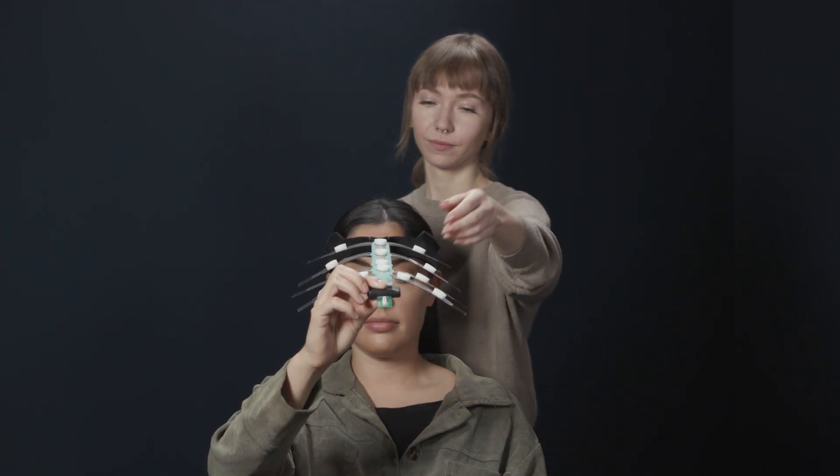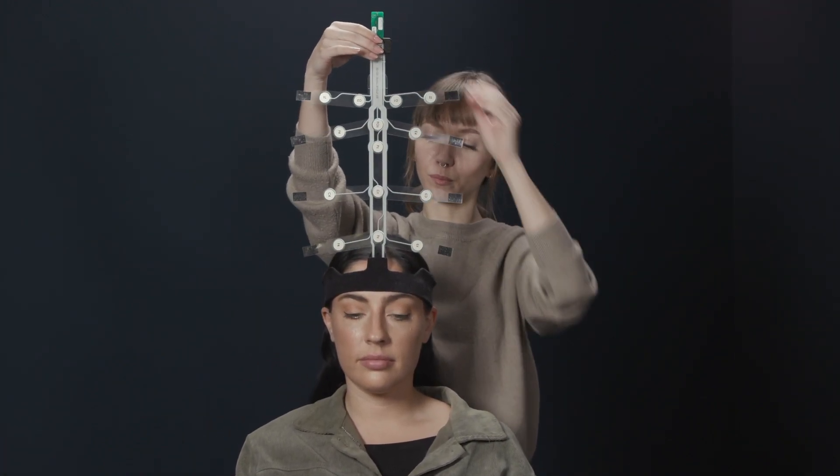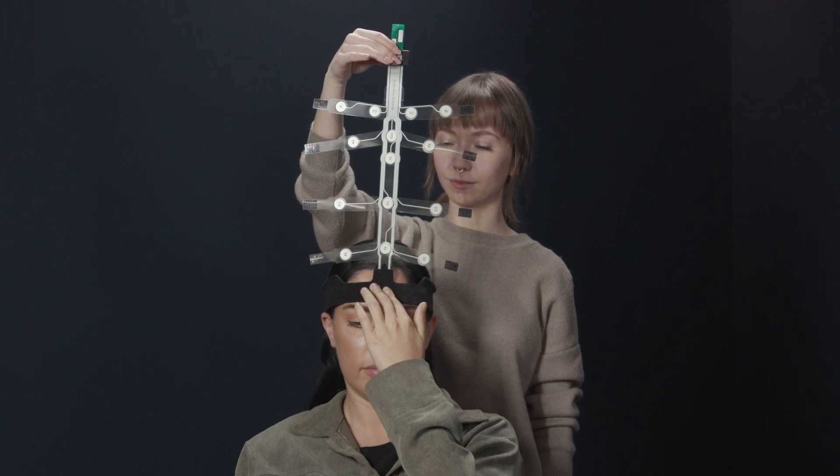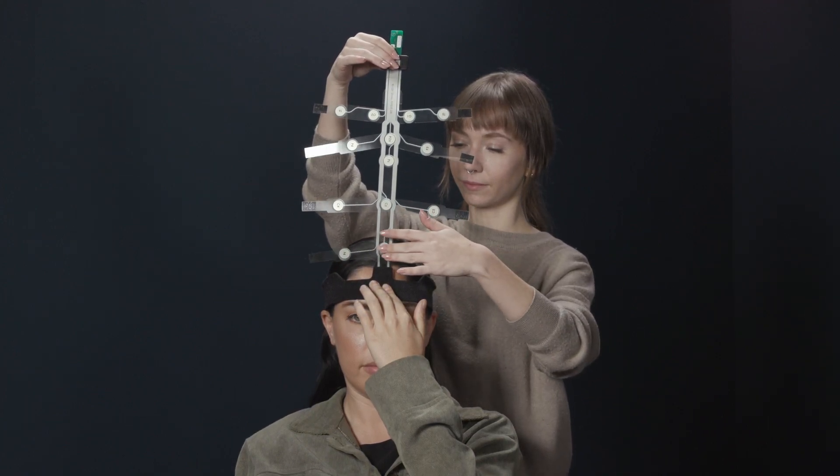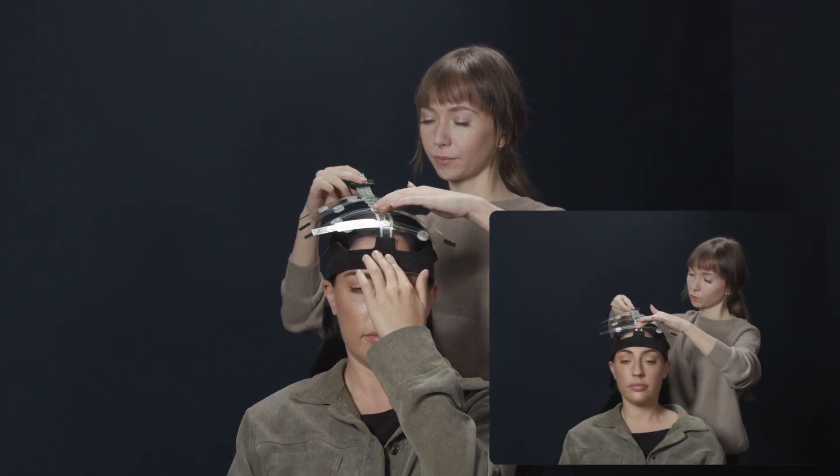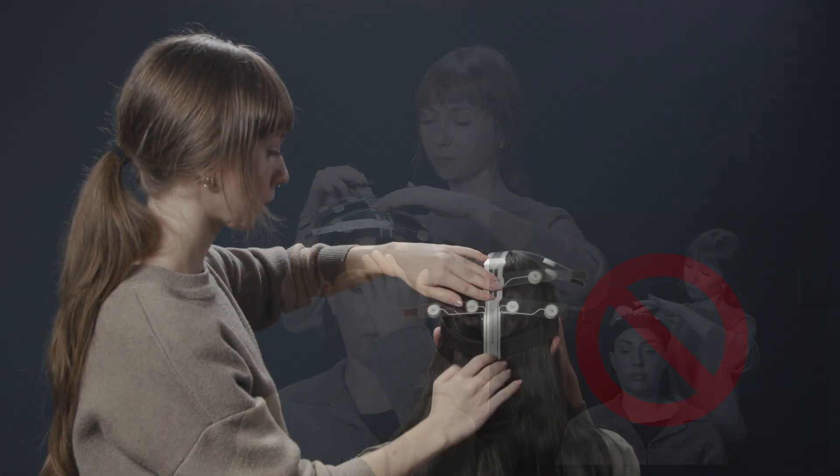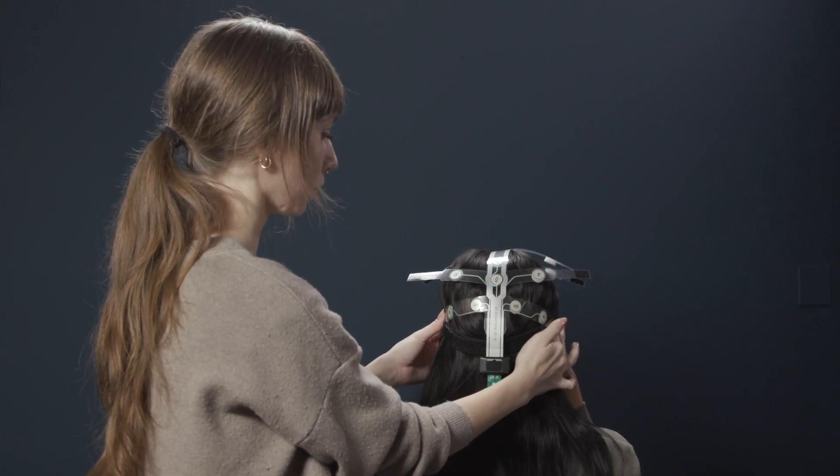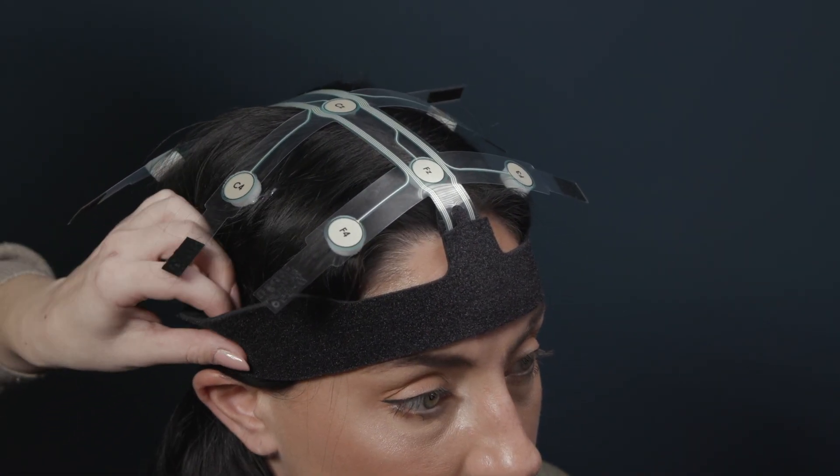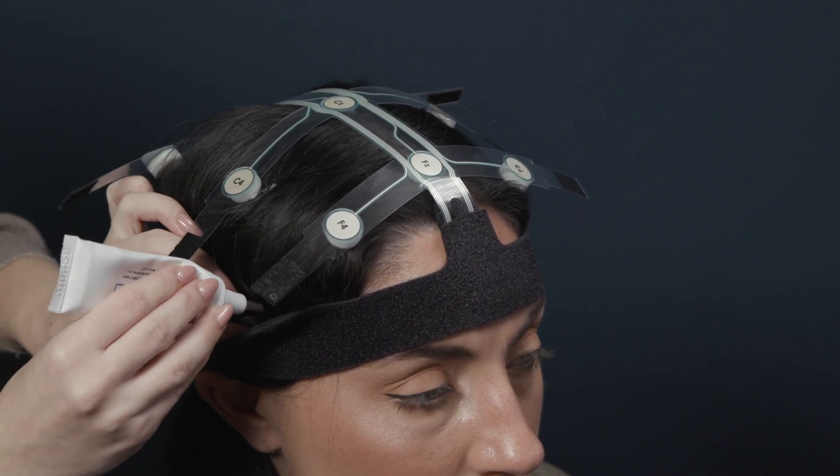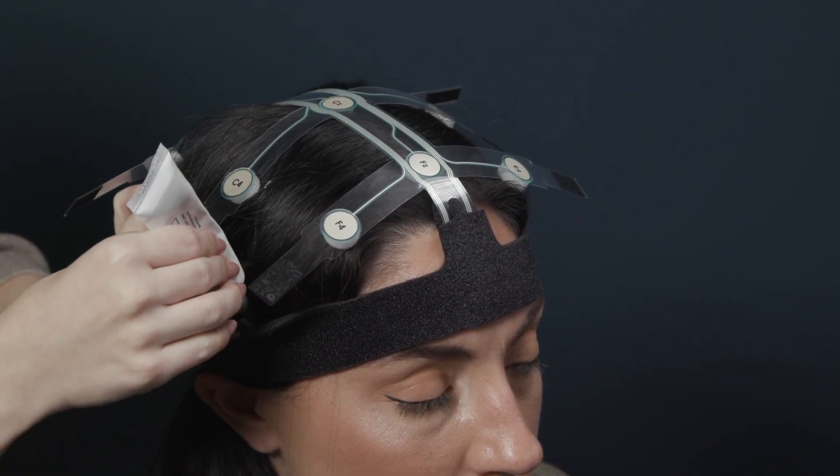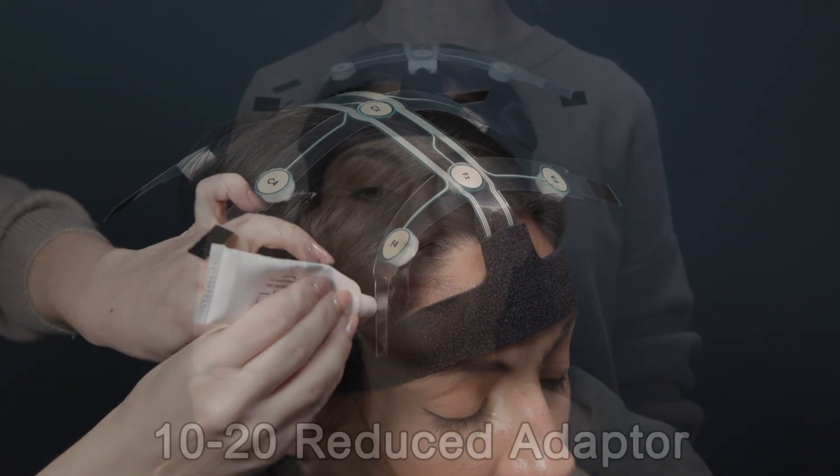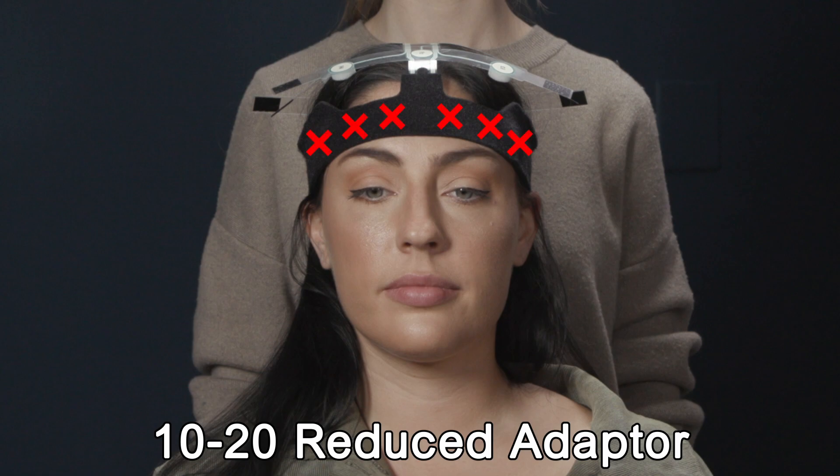Next, take the adapter from the subject and bring it up and over the top of their head. Ask the subject to press their fingers on the strap into their forehead to keep it from moving. If your participant has long hair, be sure to view the tips and techniques module as the next steps will vary slightly. Walk your fingers down the strip on the center line of the head, keeping the strip taut. Make sure not to pull on the strip so hard that it rises on the subject's forehead. Lightly fasten the two furthest back strip arms down onto the strap at the same time. This will keep the strip centered and in place while you check the temporal sensors. To ensure low impedance values, gently pull back the top of the strap to view the frontal sensors along the forehead and temple where there is hair. Use the curved tip of the cream tube to part any hair and expose the scalp to the foam sensors as needed. Refill the foam with cream for the sensors that are not directly on the forehead. Please note, if you are using the 10-20 reduced adapter, do not fill the frontal sites.